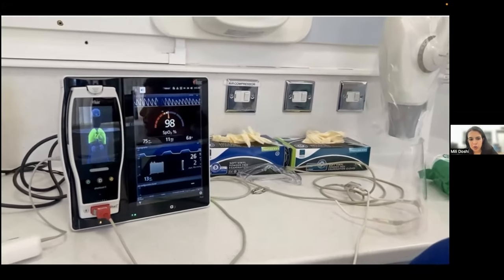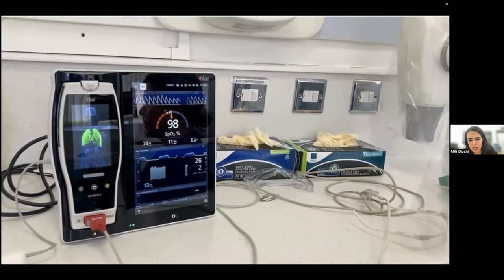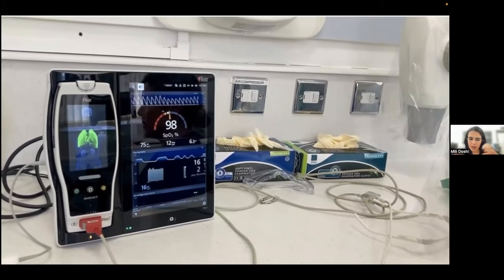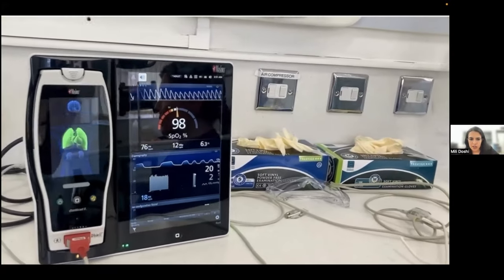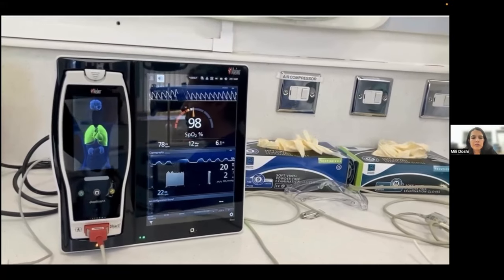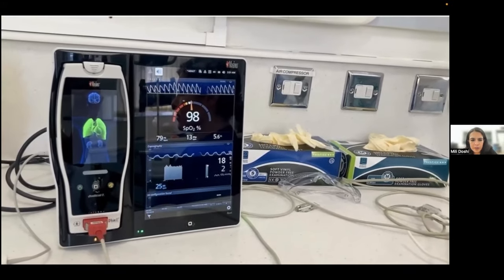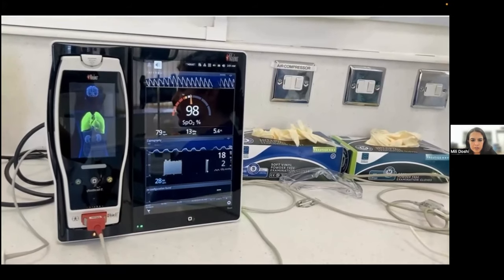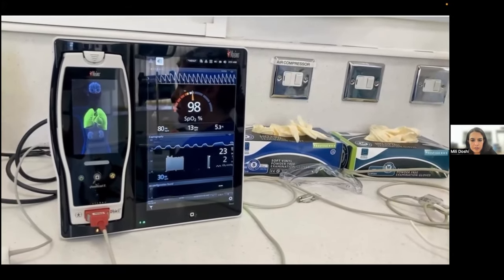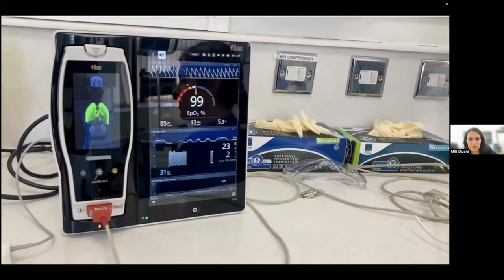So there, she's breathing normally, and then I've asked her to breathe really fast, and you can see in about 2 seconds it changes. You can see the space between the hats has decreased, and you can see the patterns change from the left to the right. Thank you. And breathe normally again. In about 2 seconds, and then the hats, a flat hat.